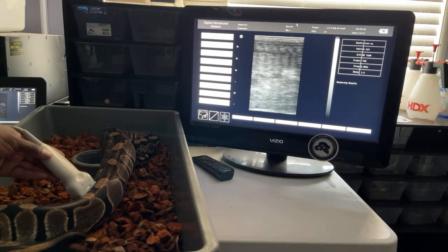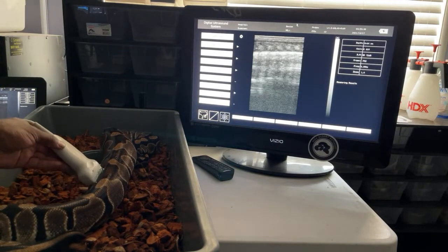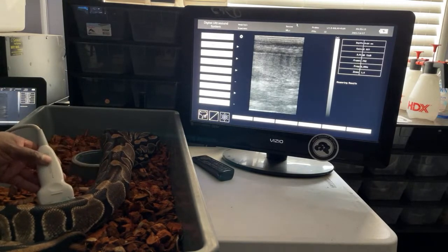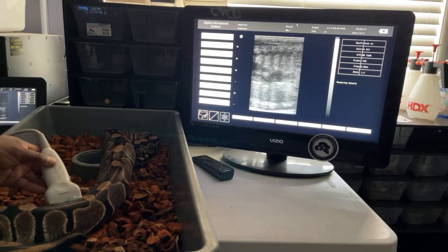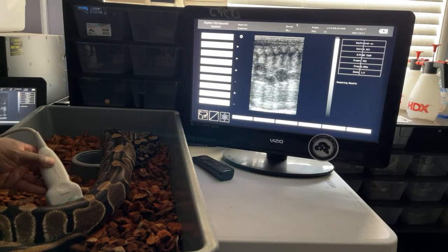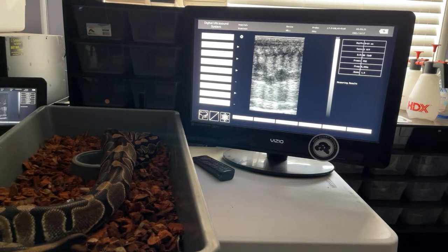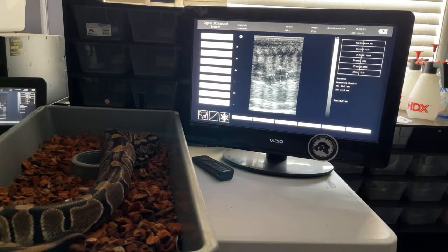Let's see if I got anything in there. I think she always carries her stuff low. Get that? So yeah, her follicles always sit low like this, no matter what stage they're on. Boom. And so just about 11 millimeters for her.